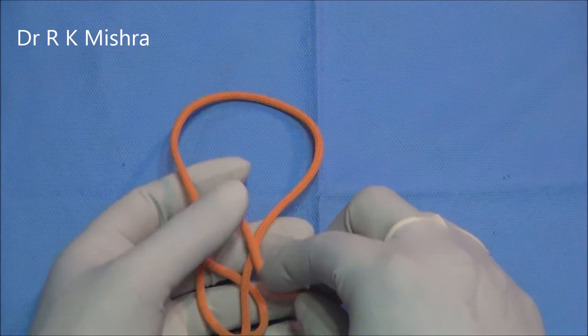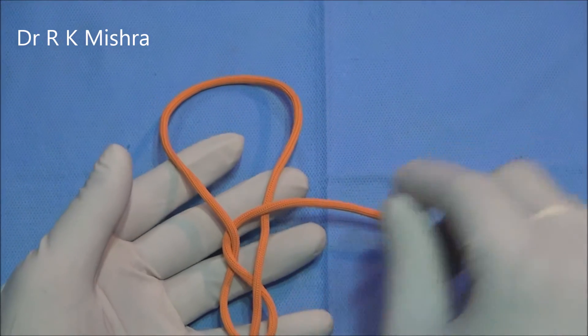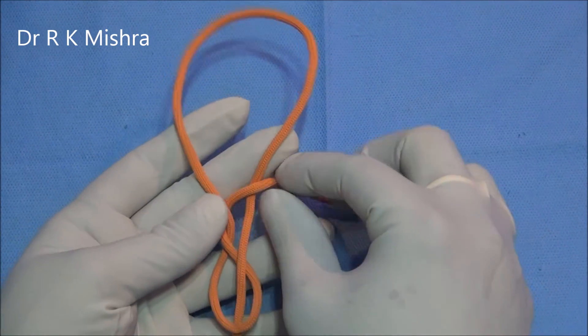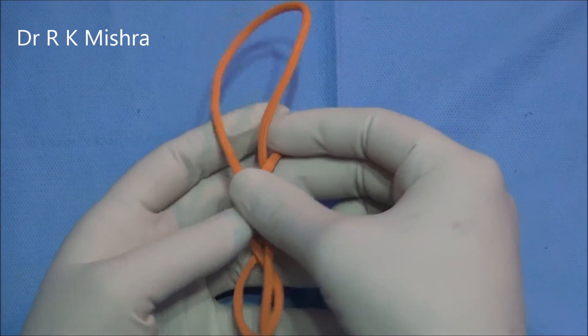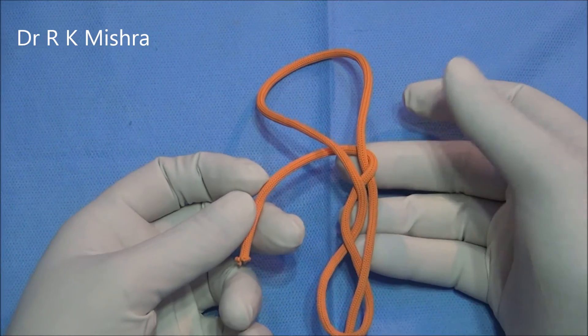Then come to the opposite limb. After that, encircle both the limbs.